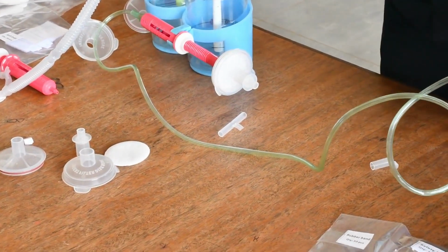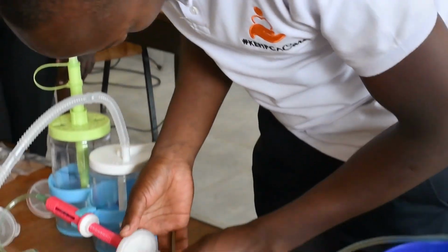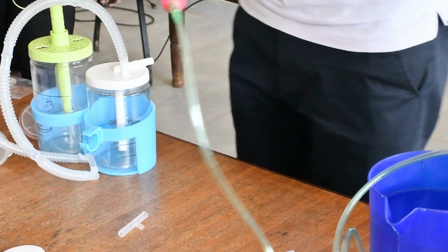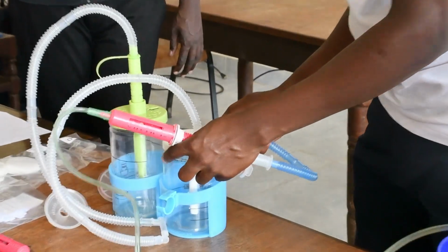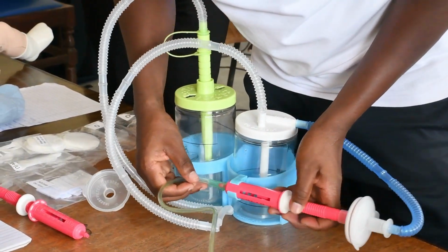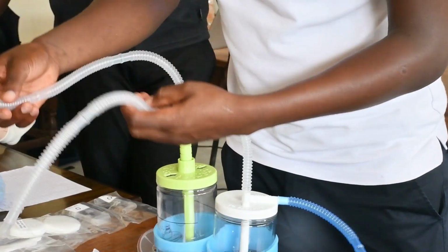Then we connect the humidifier tubing, here. Then we fit. This goes to our patient.